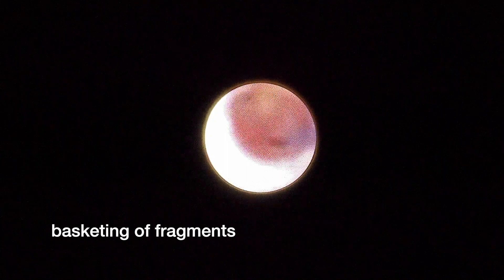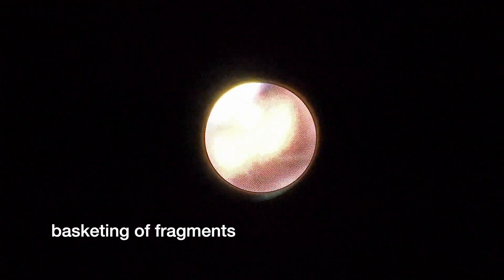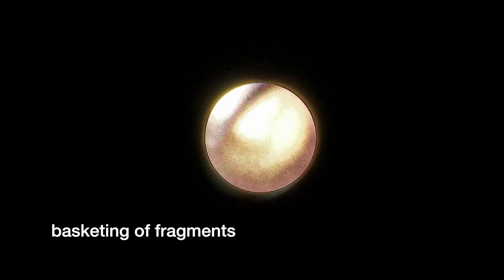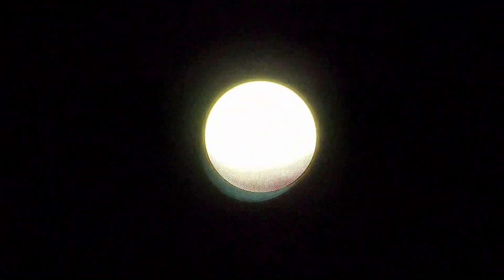As fragmentation proceeds, we can see a lot of stone debris with small particles present. Once fragmentation is complete, comes the job of managing all the debris created. Here you can see basketing of the individual fragments to ensure the duct is free of all stone fragments. The basketing procedure is then used to completely remove all large fragments. A couple of fragments also come out during flushing, which are subsequently extracted.